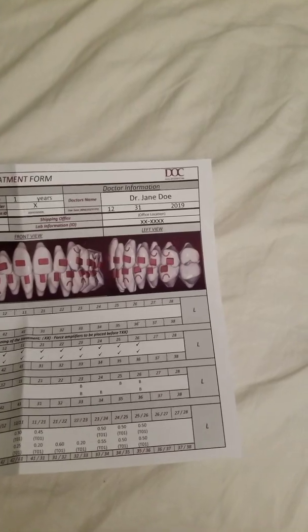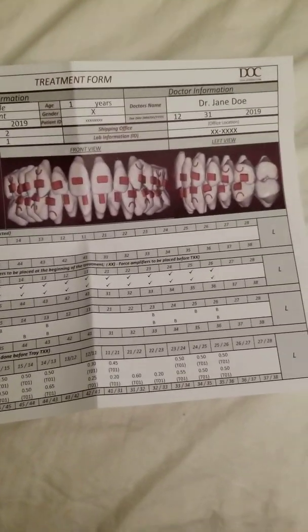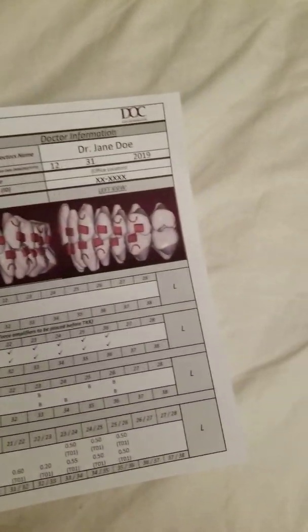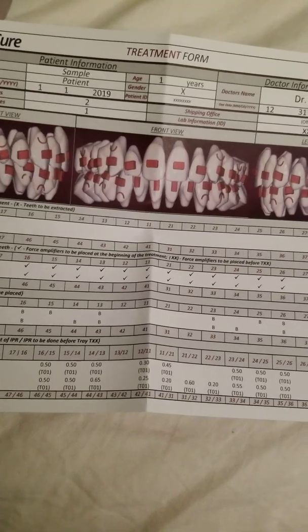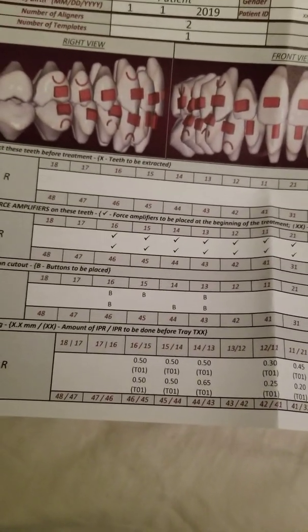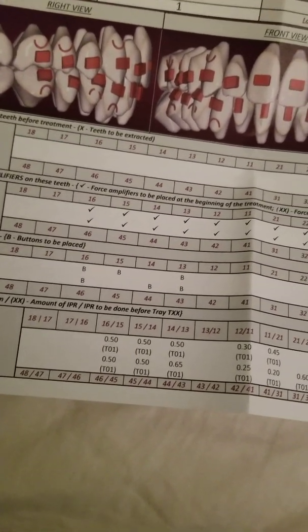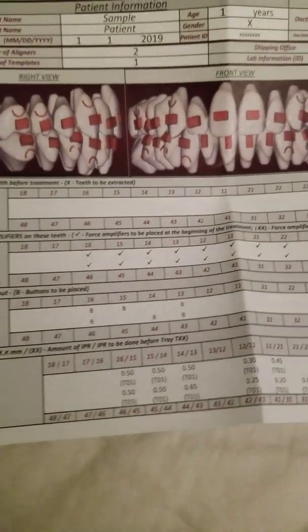So they basically tell you, okay, if you want to extract teeth, you mark that. If you want force amplifiers, I really don't know what that is. What is a force amplifier? Okay, whatever. I'll have to look that up. There's button cutouts here. Maybe force amplifier is their word for attachments. That's probably it. Force amplifiers to be placed at the beginning of treatment. Force amplifiers to be placed before TXX.